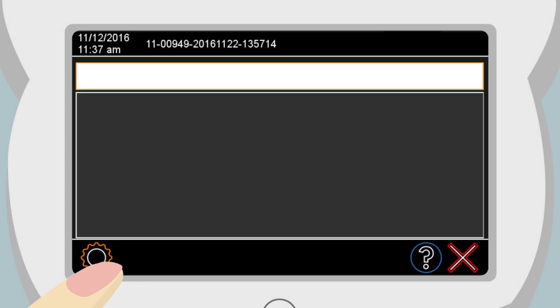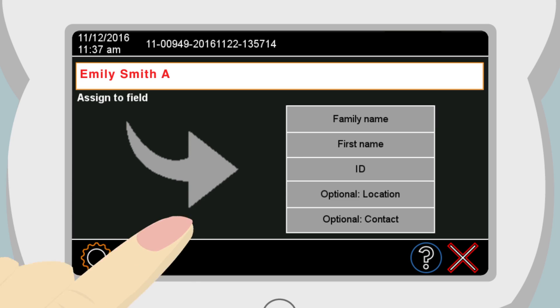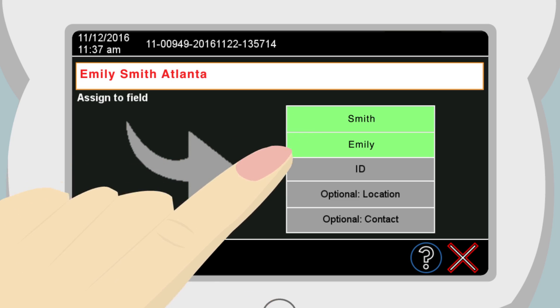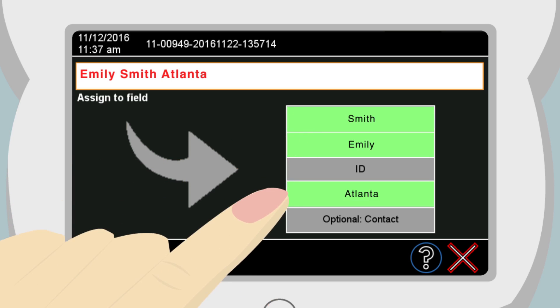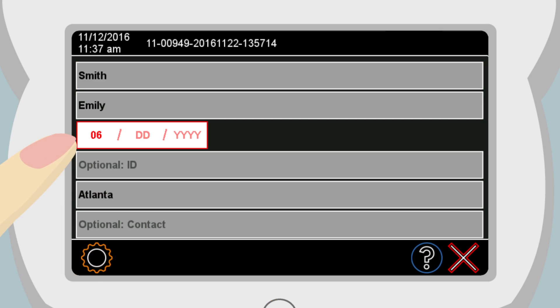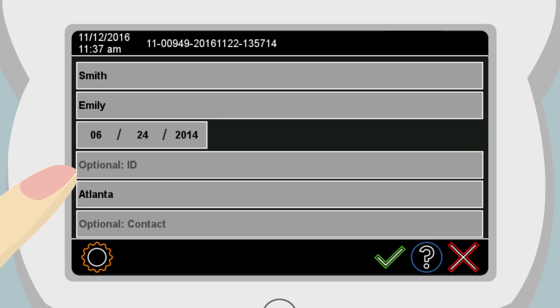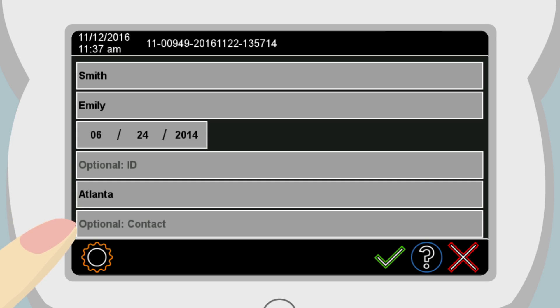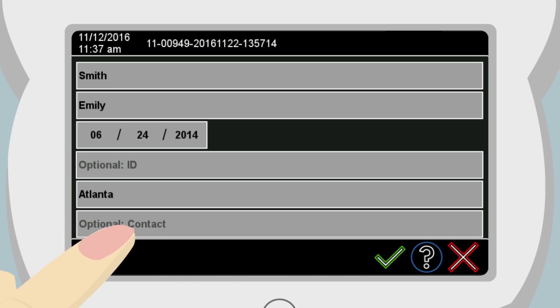To be able to uniquely identify a patient in the database, enter the patient's name plus date of birth, or patient ID plus date of birth via your USB keyboard. As an option, examination location and/or contact information can also be saved in the database. Touch the green checkmark in the navigation bar to confirm your entry.